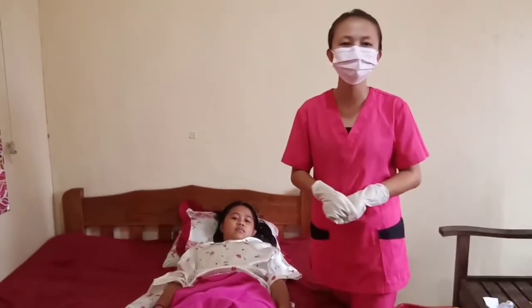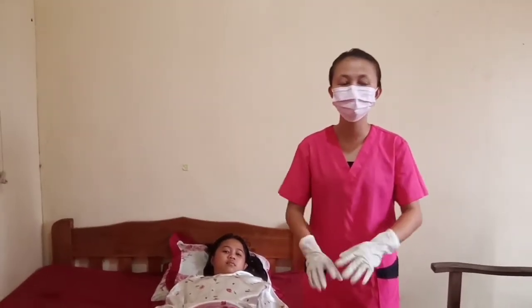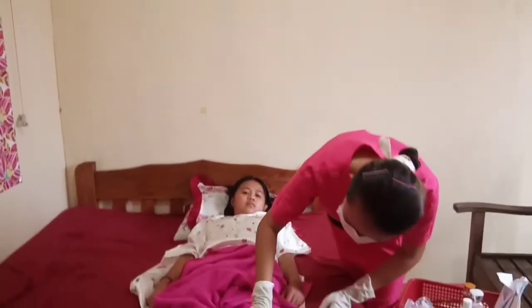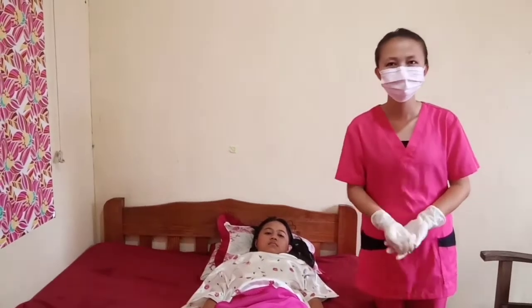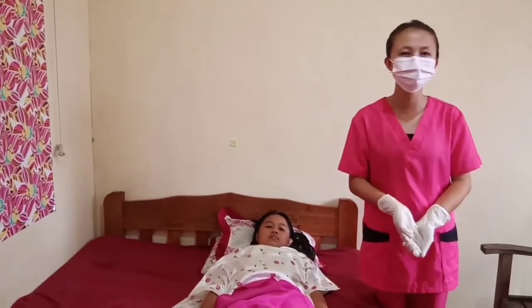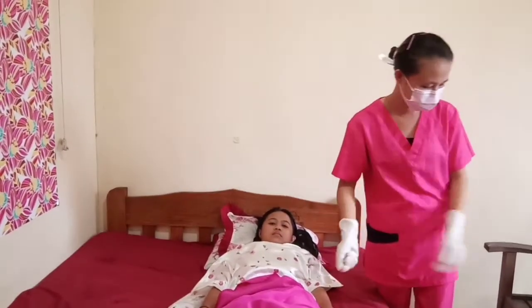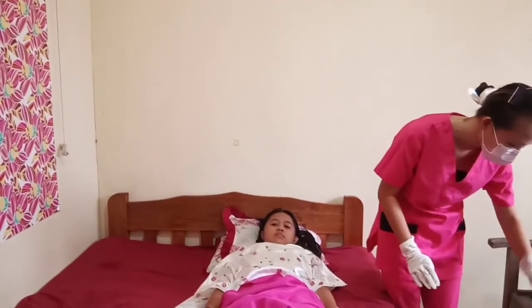And now it's time to inspect wound for appearance, drainage, and integrity. Avoid contact with contaminated materials. And now, cleanse wound with solution. Use a separate swab for each cleansing stroke and then clean from least contaminated area to most contaminated area. So I have here the swab, the sterile swab.